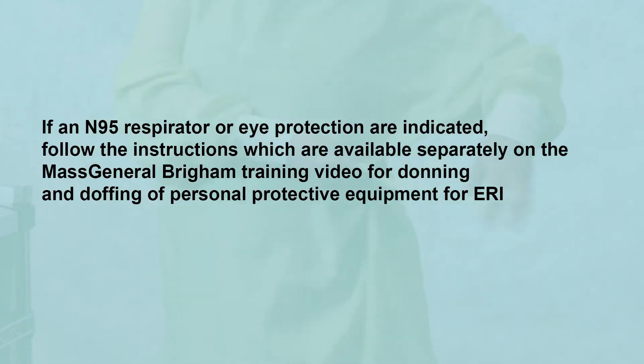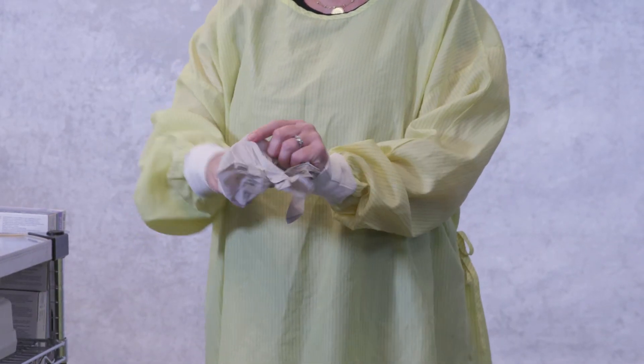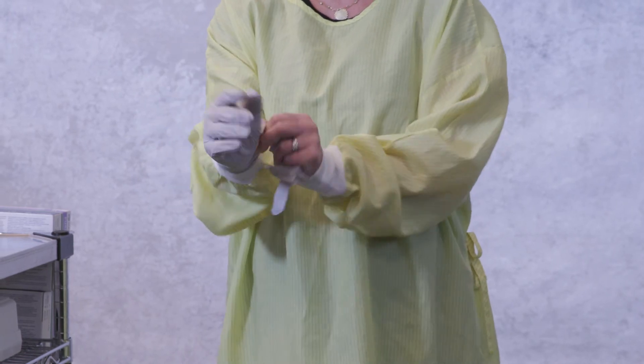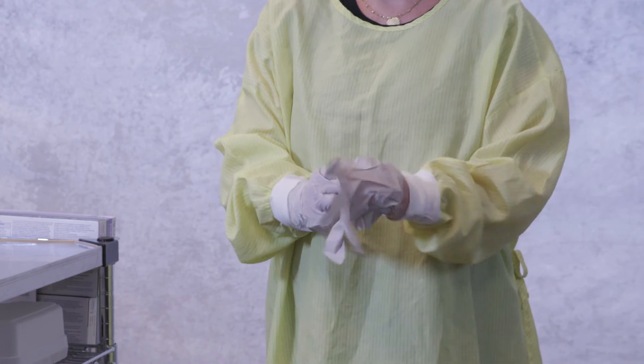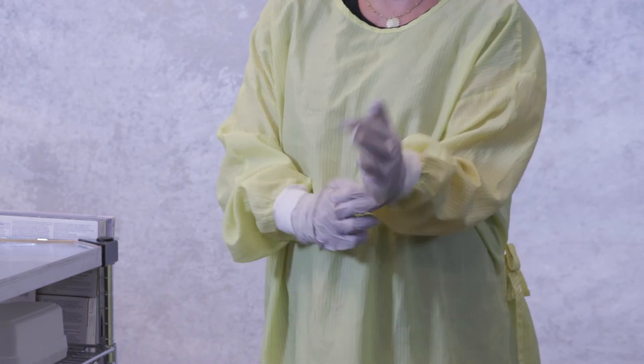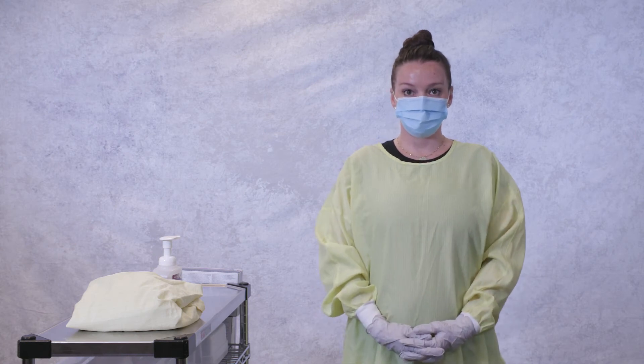If N95 respirator or eye protection are indicated, follow the instructions which are available separately on the Mass General Brigham training video for donning and doffing of personal protective equipment for ERI. The final step of donning a gown and gloves is putting on the gloves. Gloves should be pulled up over the cuffs of the gown.